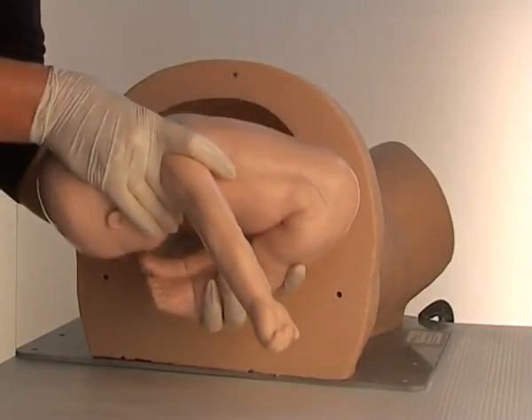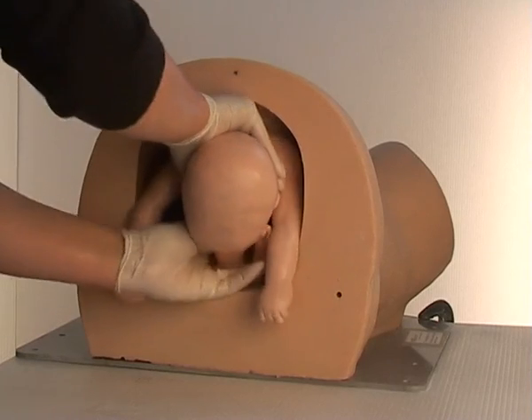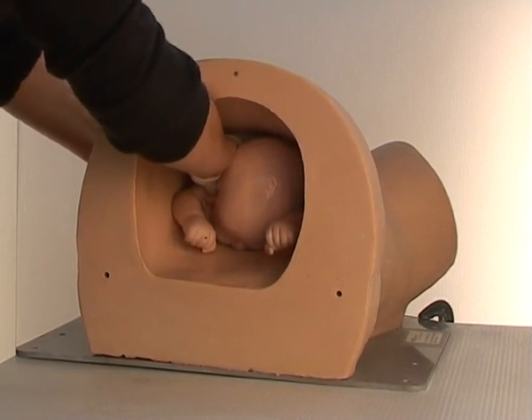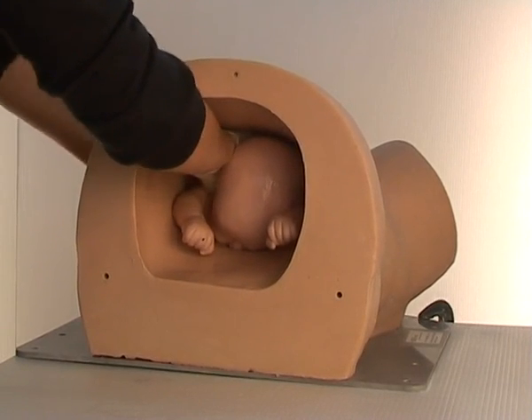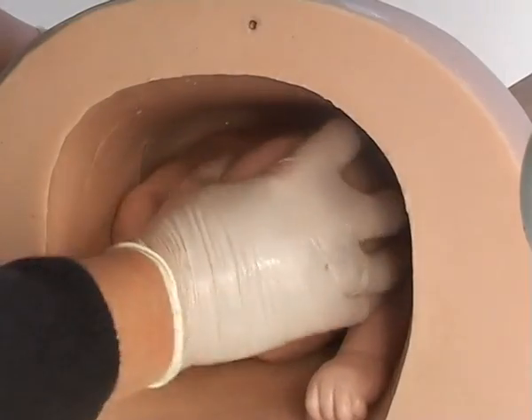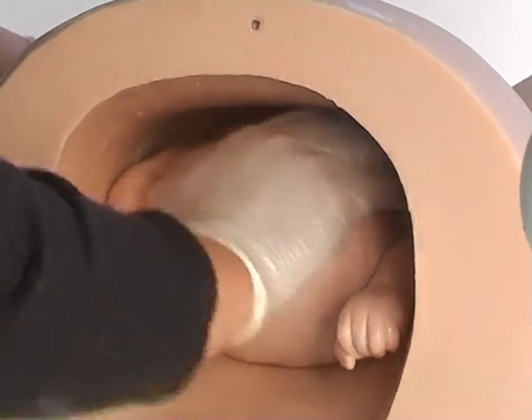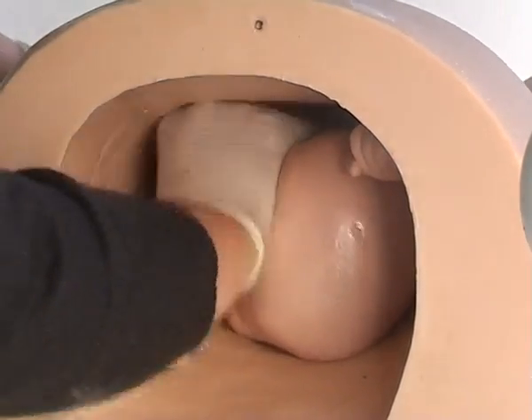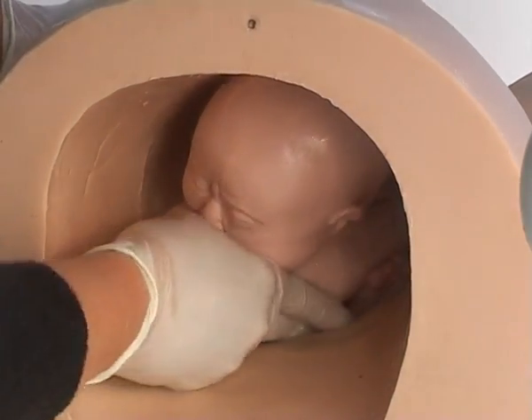Fold Sophie over and insert her into Sophie's mum's pelvis. Your hand will be on the back of her neck, pushing on her shoulders to move her into the birth canal. You can push on Sophie's head to continue her movement through the birth canal. Always ensure that her arms are in front of her body and not behind her head, as this can put undue stress on her skin and skeleton.